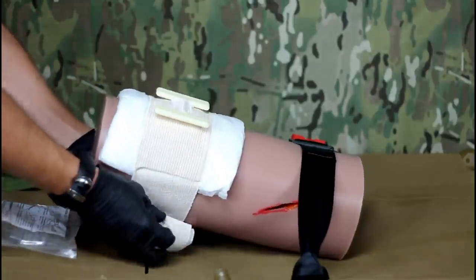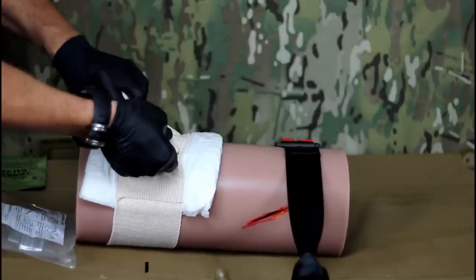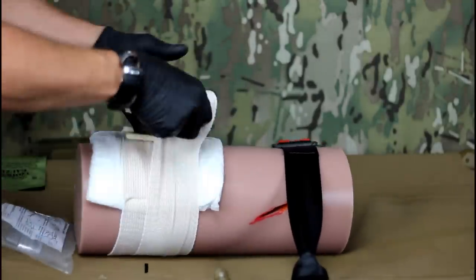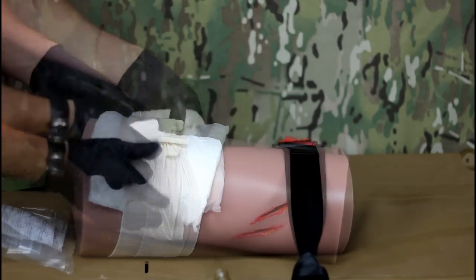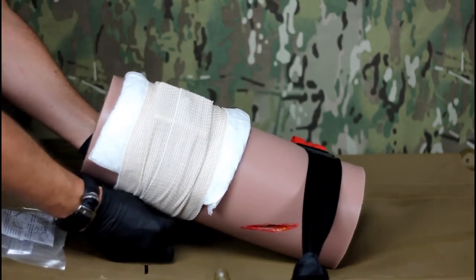Use your issued pressure dressing or other appropriate materials to bandage the wound tightly, securing the combat gauze in place once bleeding has stopped. The dressing should both maintain pressure on the wound and prevent further contamination of the injury site.